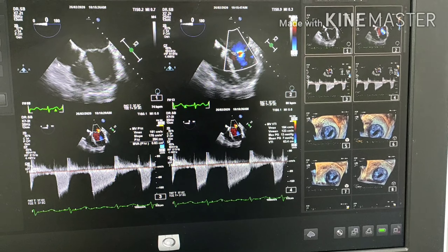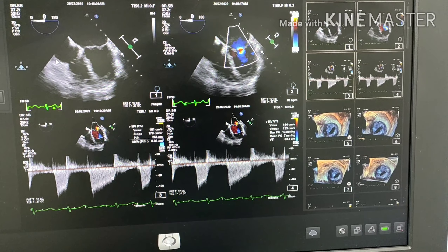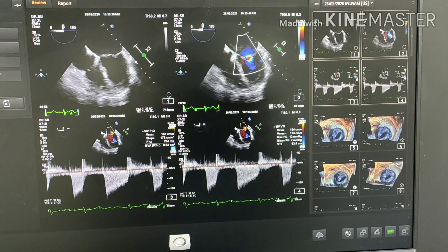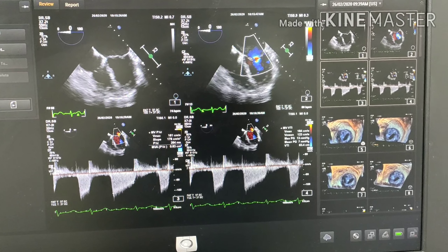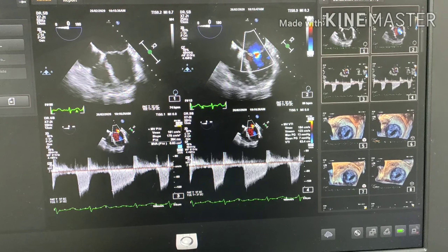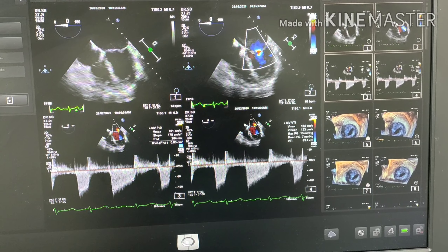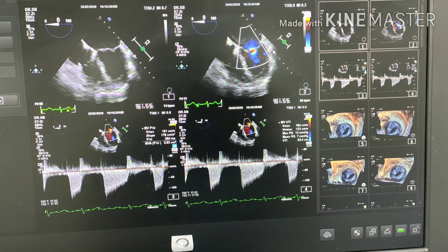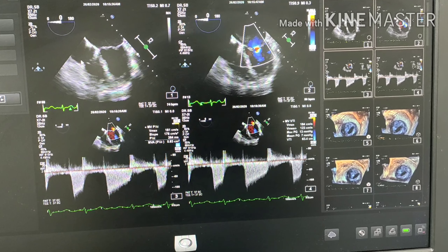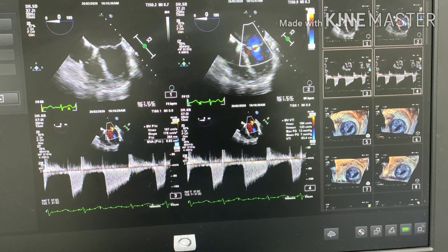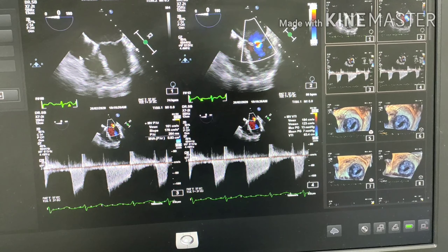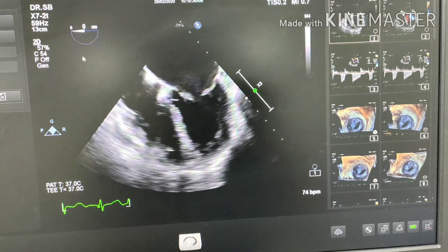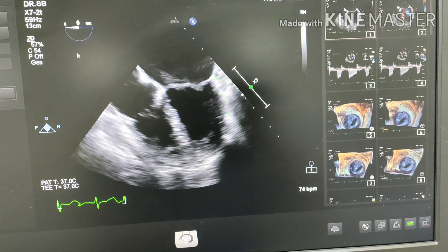Hi, good afternoon guys. Today what we're going to do is review a case of rheumatic mitral stenosis and you'll see how 3D is different from 2D in assessment of a rheumatic mitral valve.